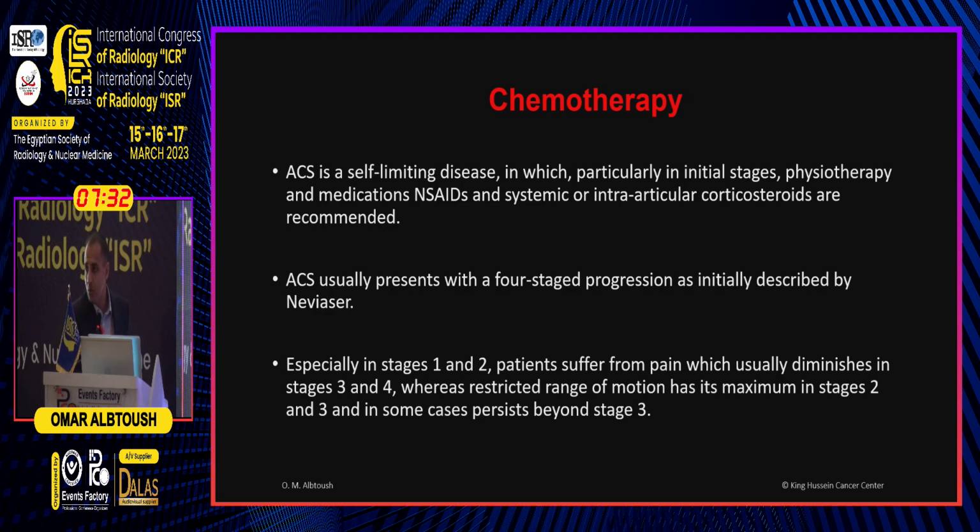I used to do a distension for it, but to be honest, it was not successful. It was a fluoroscopic guided distension. It's a very painful procedure for the patient, and the outcome is really poor.